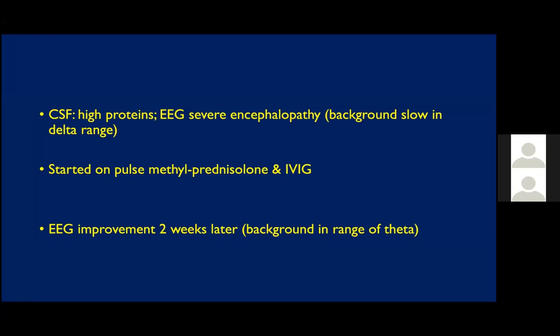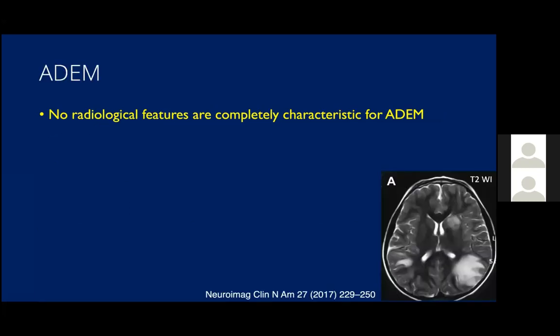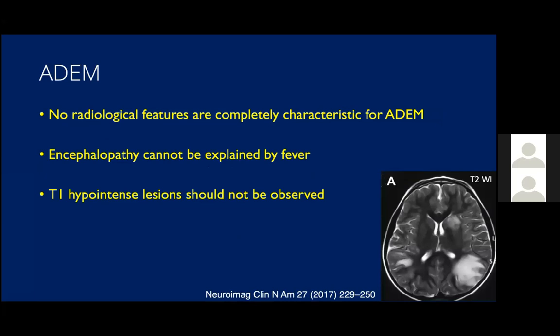So again, I will show you today these cases, how proper imaging and guidelines can help us to correctly diagnose these things, and how we are not doing it in our routine practice. So ADEM is basically a disease of white matter. It doesn't have any radiological features that completely characterize ADEM lesions. Encephalopathy cannot be explained by fever in ADEM, and T1 hypointense lesions should not be observed in ADEM patients. That is typical for MS, T1 hypointense lesions.